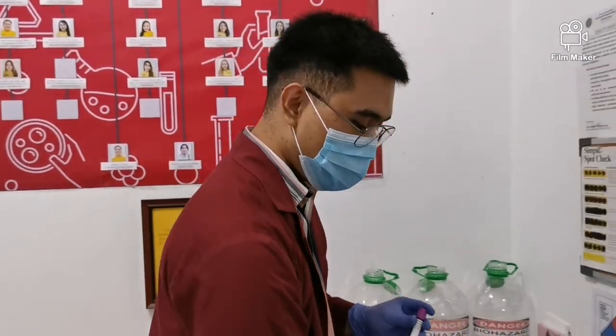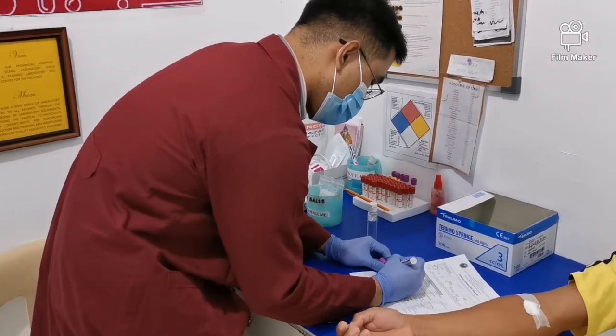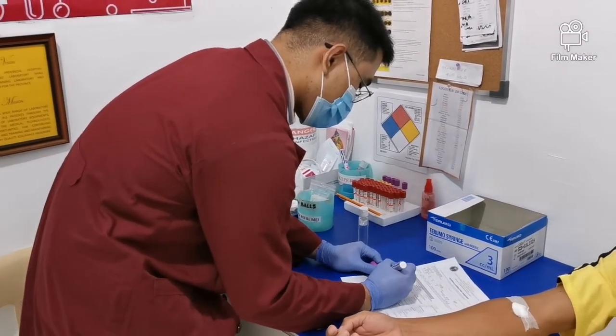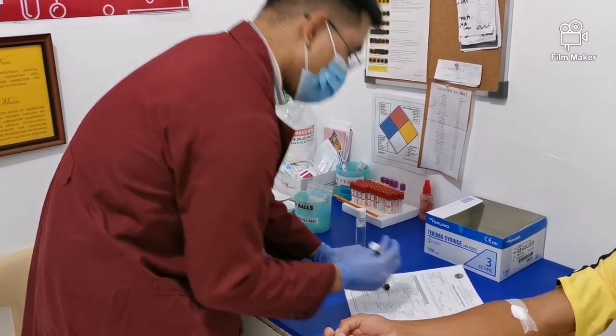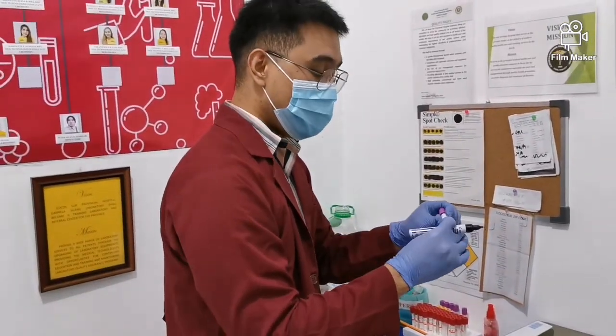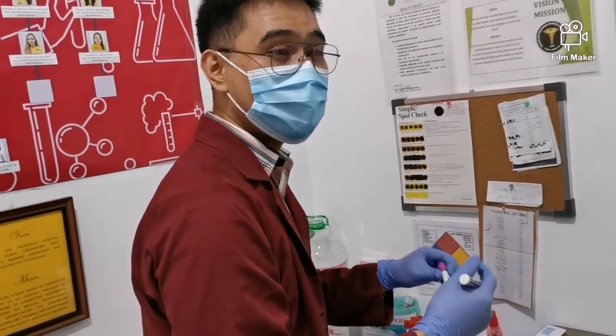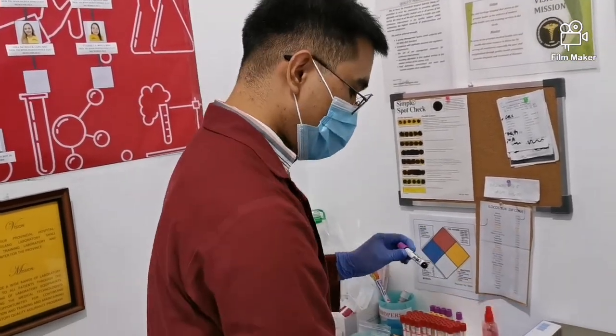And then, ask again for the name of our patient. Pangalan mo ulit, sir? Marino. So dapat ganon, properly labeled, dapat do the labeling after you extract the patient, okay? Para maiwasan mo yung specimen mix up.